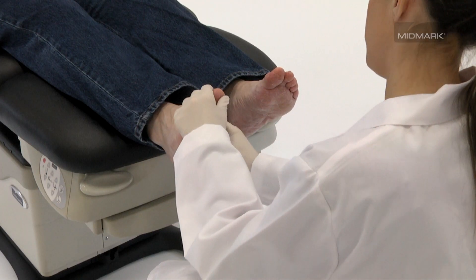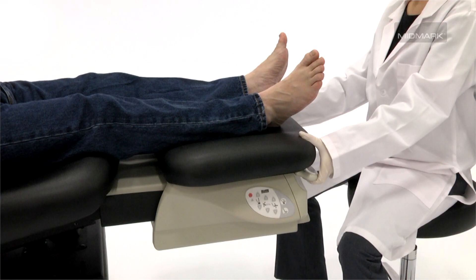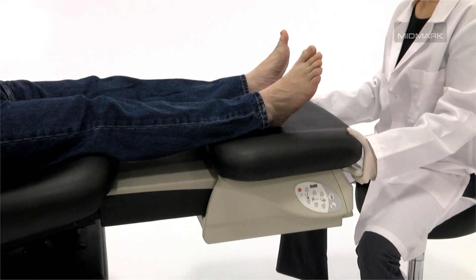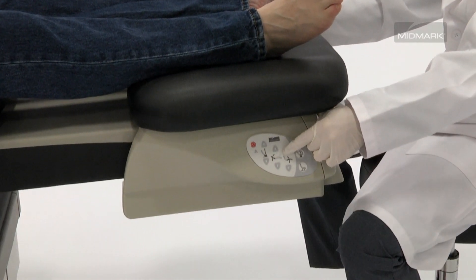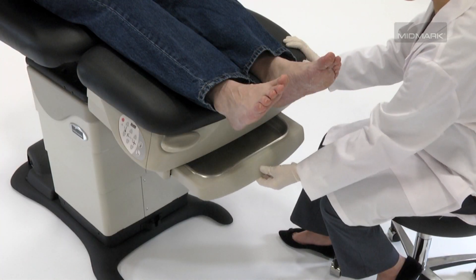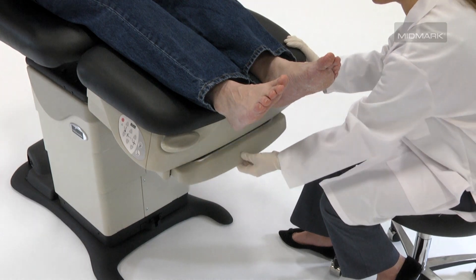A best-in-class foot section design puts everything you need where you need it, at the point of care. Designed to be intuitive and easy to operate, the foot section is equipped with one-handed release levers and integrated touch pad controls located on either side, as well as an integrated stainless steel debris pan that can be used when you need it and stored out of the way when you don't.